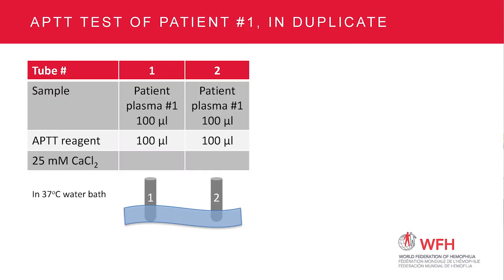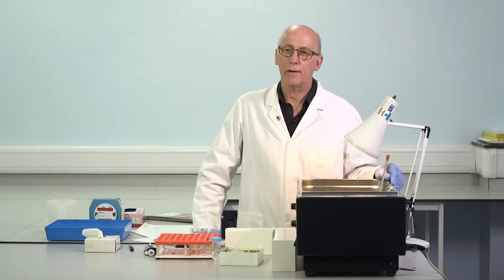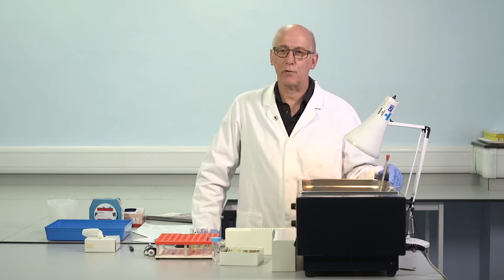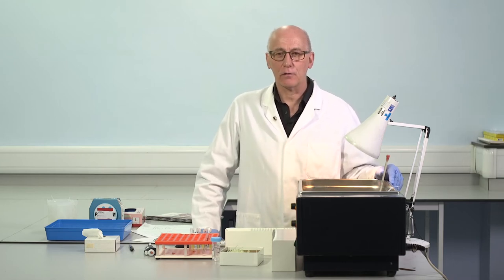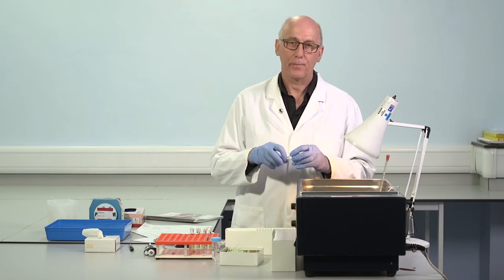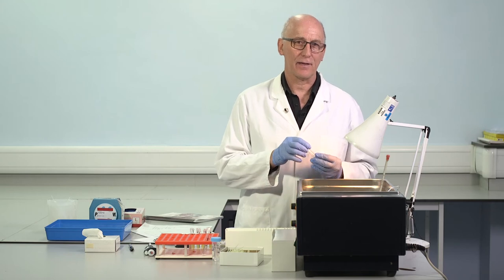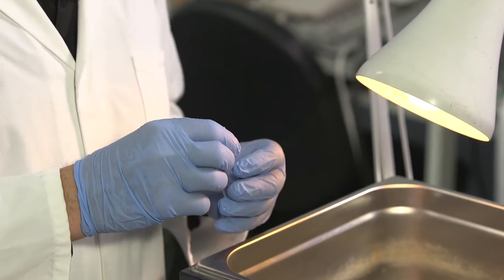So whilst that's incubating, I mentioned the tilting of test tubes. There is a recommended method for tilting test tubes. It's defined by the World Health Organization, in relation to testing of samples for control of anticoagulant therapy. And what their recommendation states is that the test tubes should be tilted three times every 5 seconds through an angle of 90 degrees. Three times every 5 seconds.